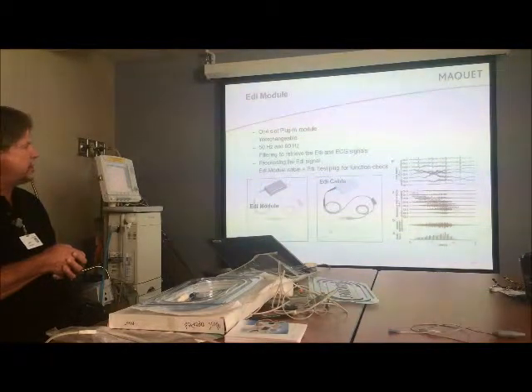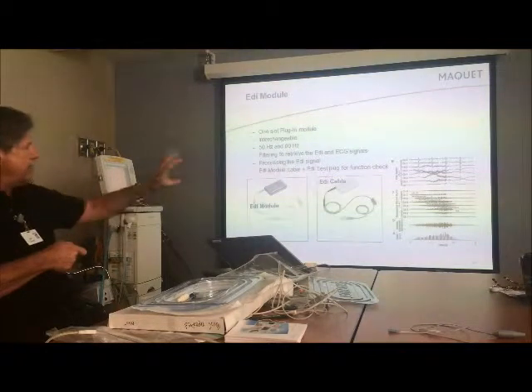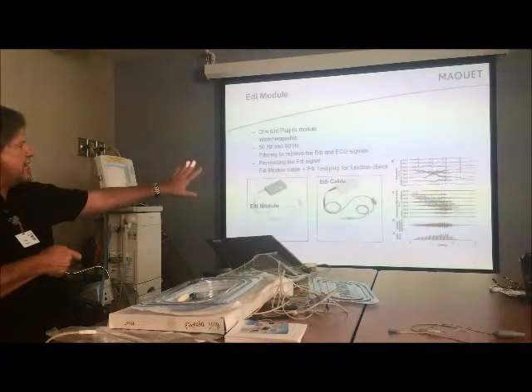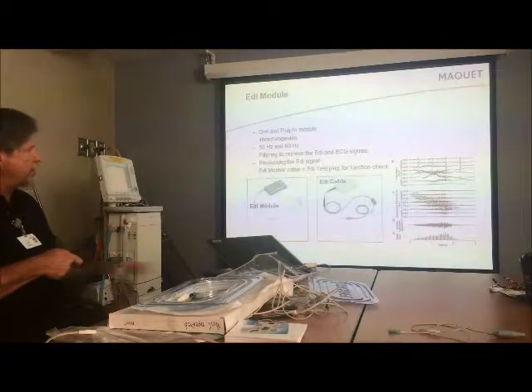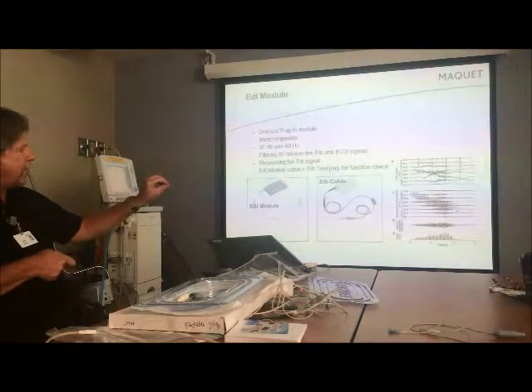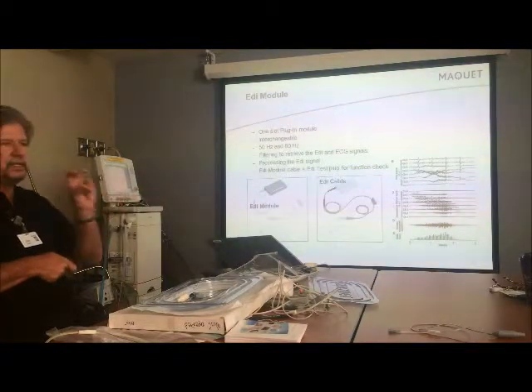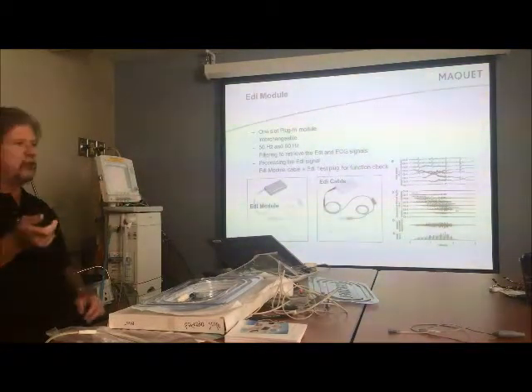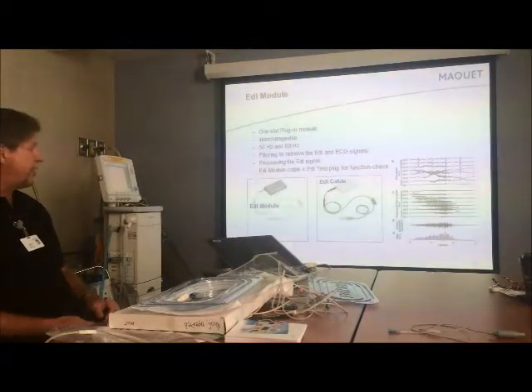that the ventilator sees, and it's smaller than that of the electrical activity of the heart. Then the software filters out the EKG signal, creating the pure EDI signals on all of the waveforms. Then it combines all that information to create one EDI, and then it gives you a display of the electrical activity, the contraction and the relaxation of the diaphragm on the ventilator.